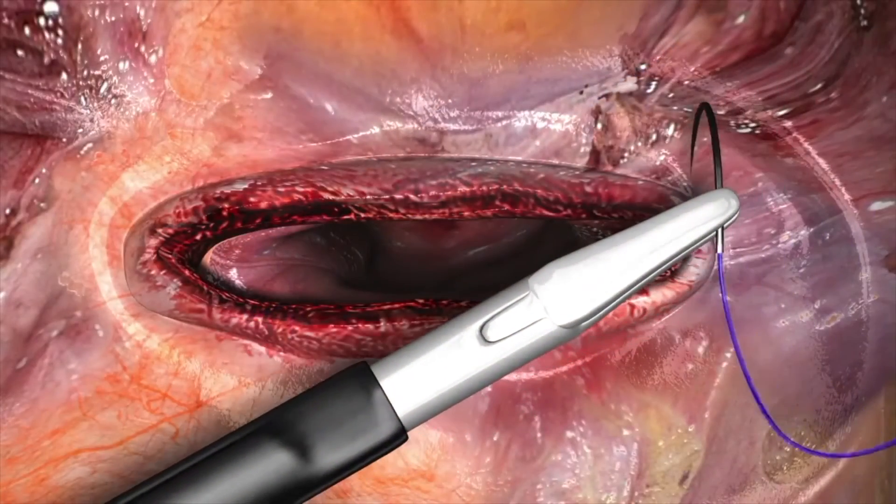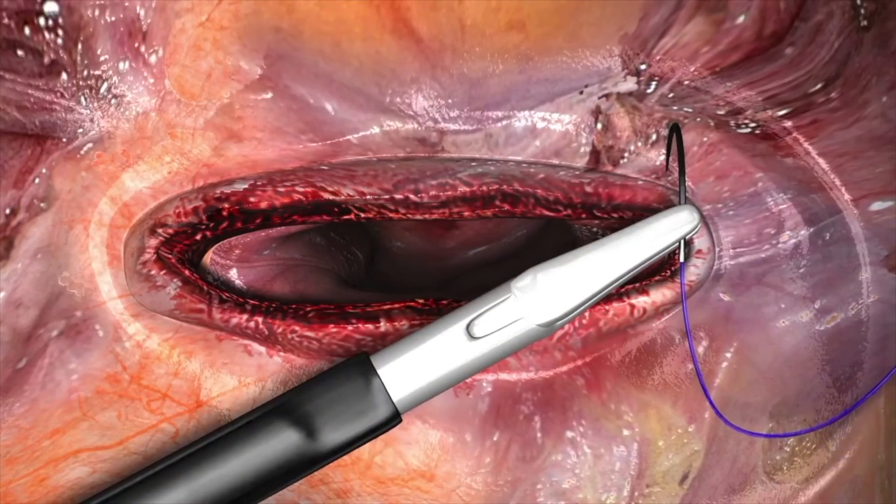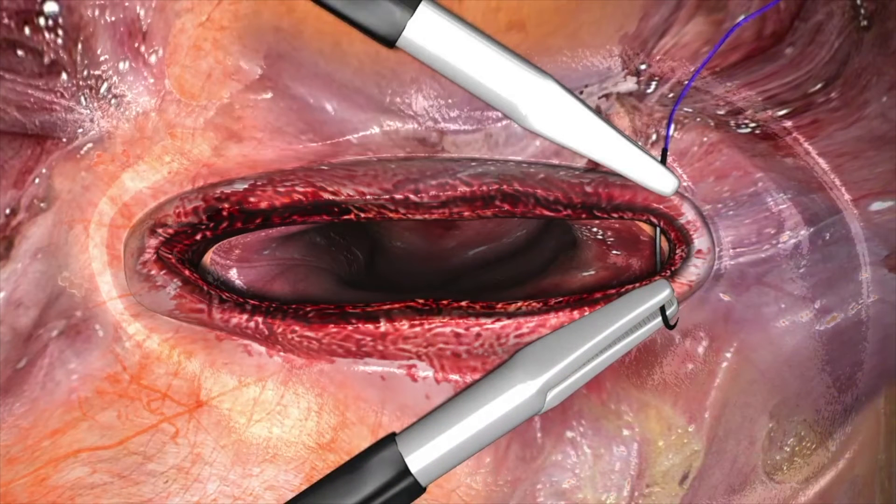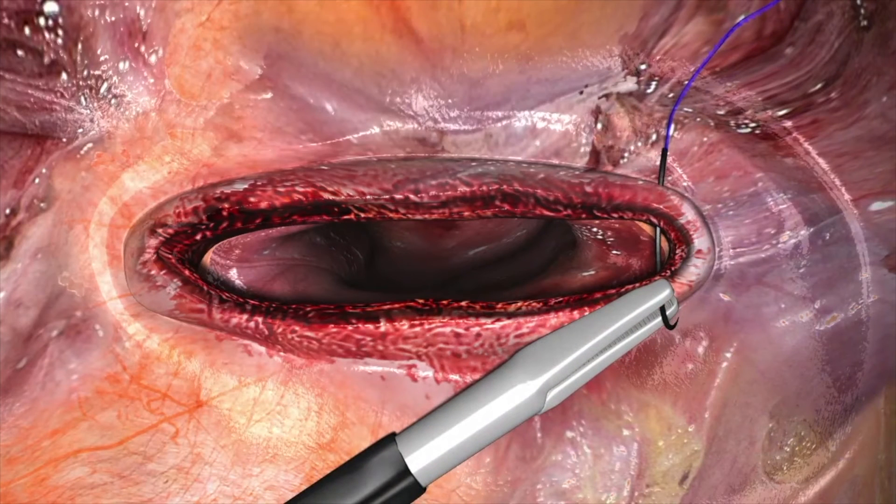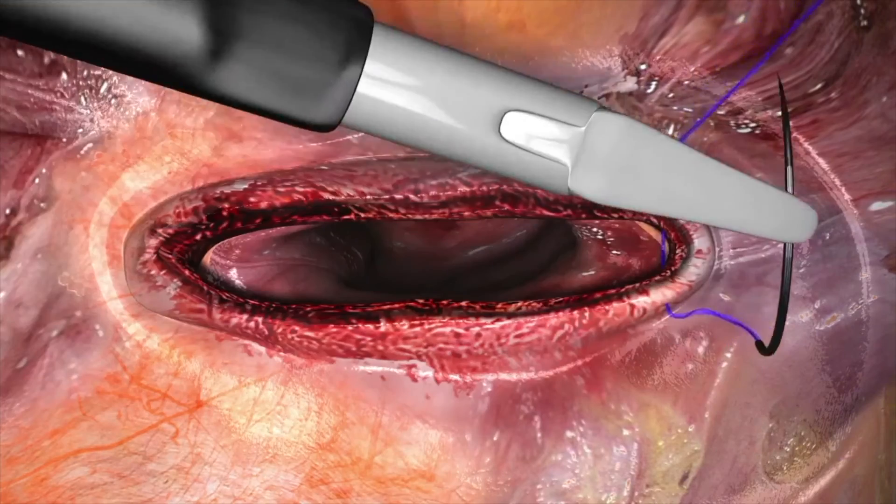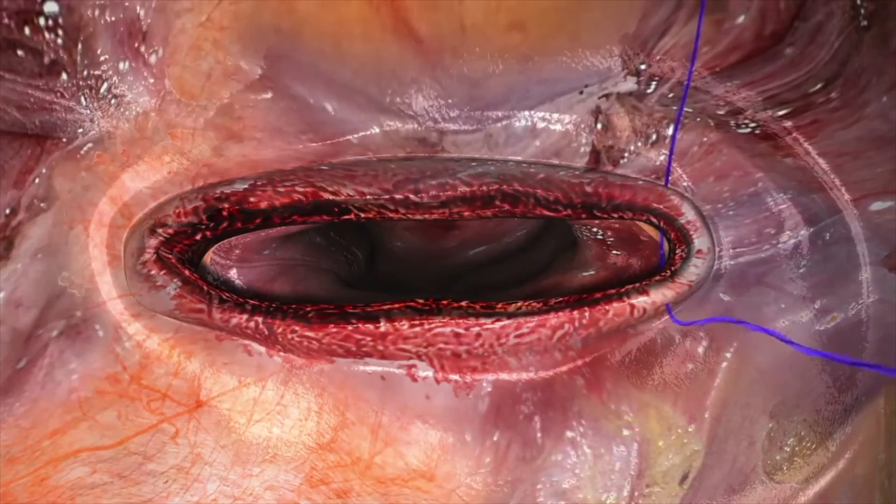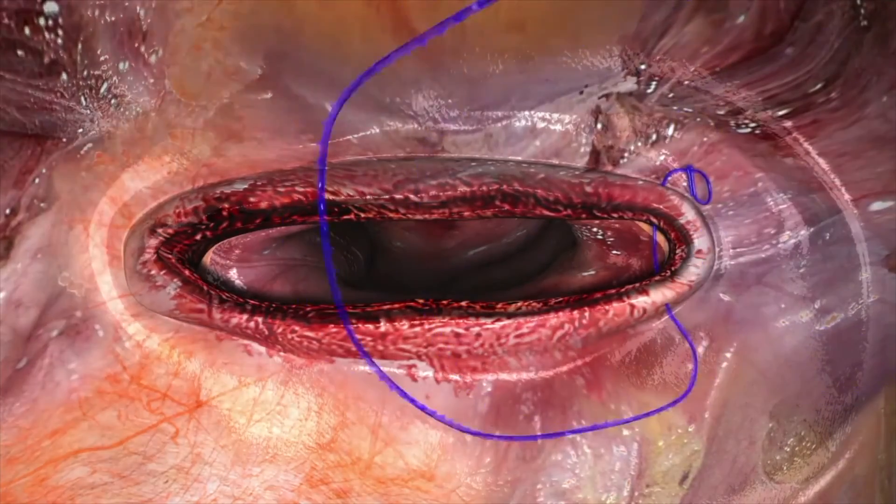Grasp the needle and take the first pass through the tissue, and then slide the fixation loop over the needle.